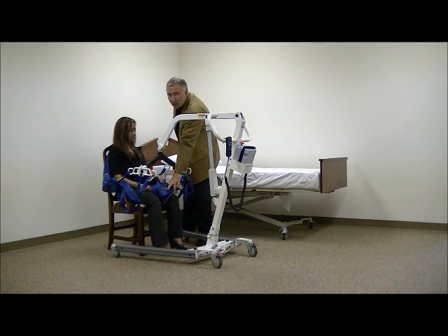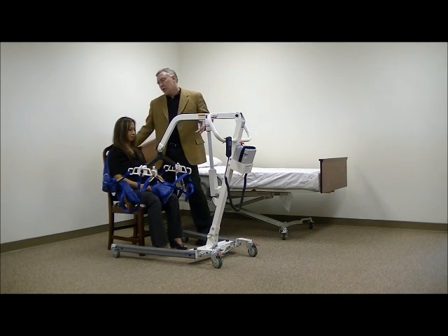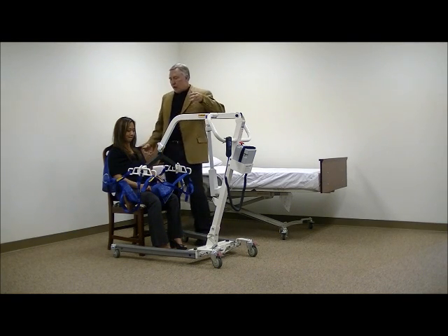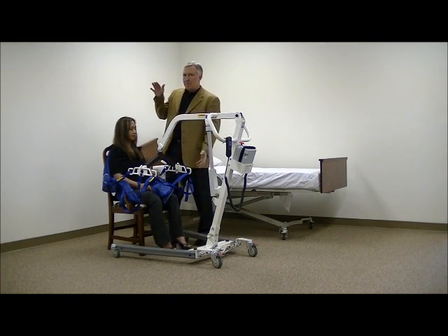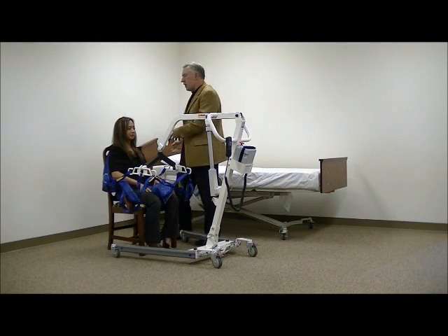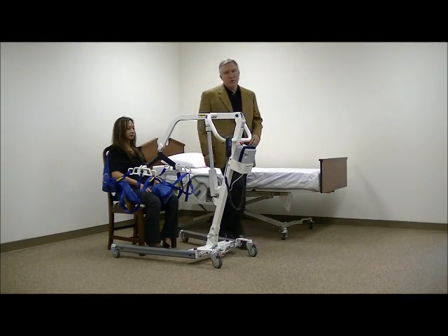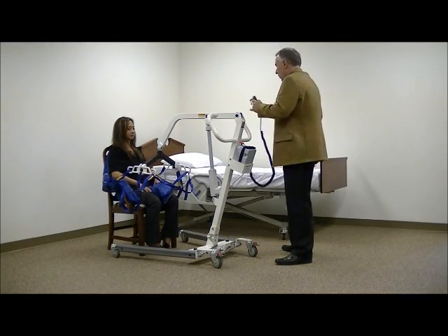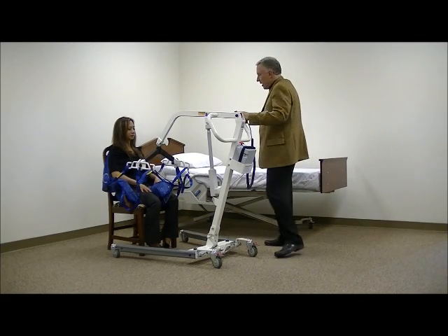The shorter you make the legs, the longer you make the shoulder area, the more it tilts the person back. If you do the opposite, it's going to sit the person up. So you can control that positioning. So when you're going from the chair to the bed, you're going to want to lay the person back. It makes the person go higher in the air, plus it makes the person in the right position when they're going into bed. So we hit the up button.